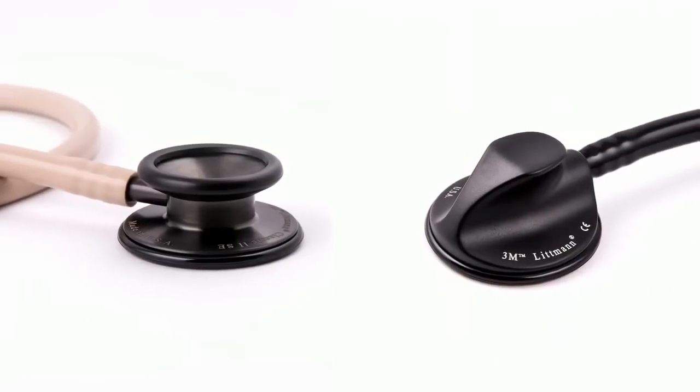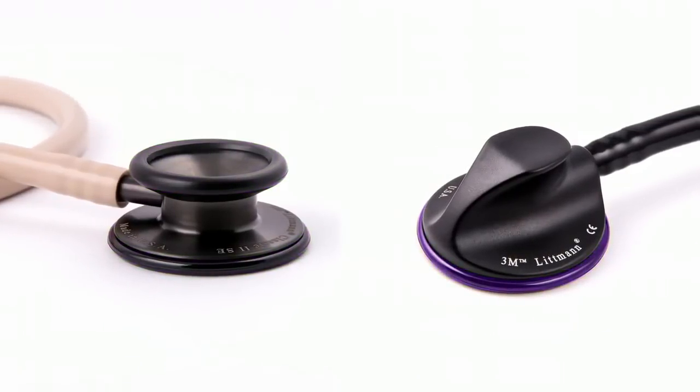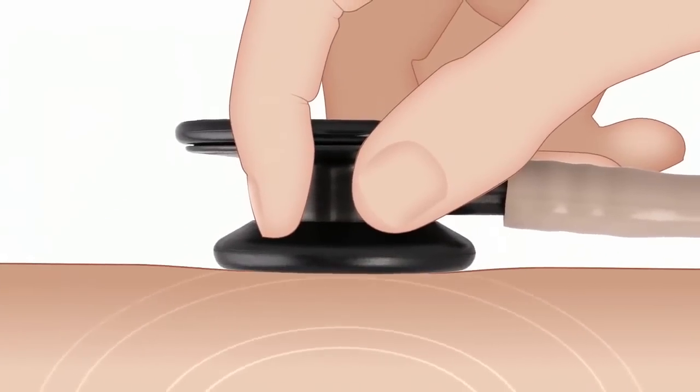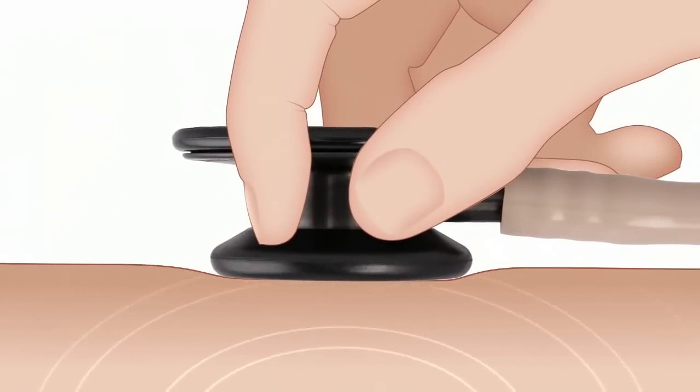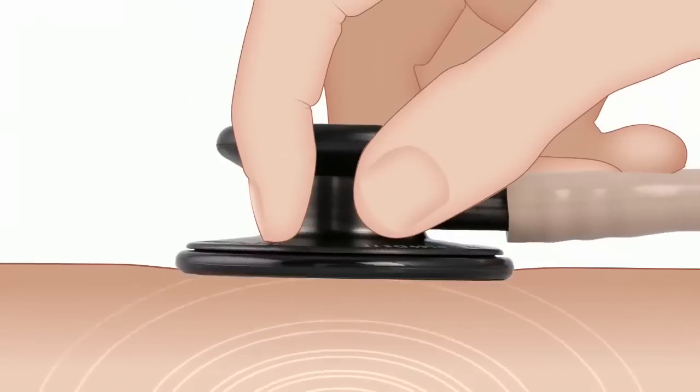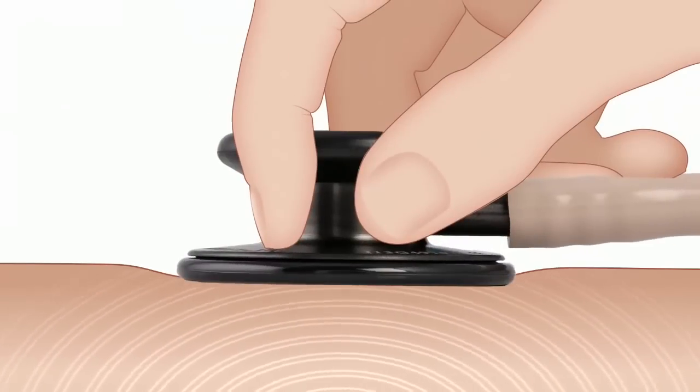There are two types of Littmann chest pieces: double-sided and single-sided. With the double-sided chest piece, use the open bell on the small side to listen to low-frequency sounds and the diaphragm on the large side for high-frequency sounds.